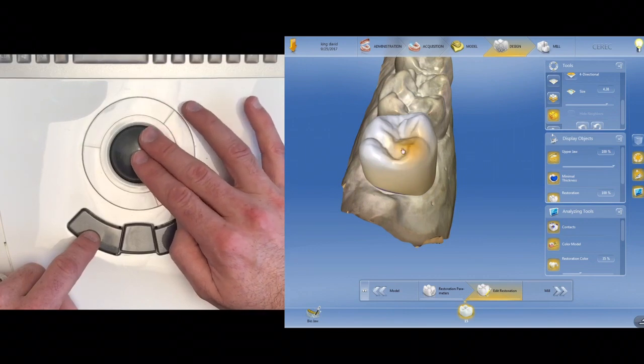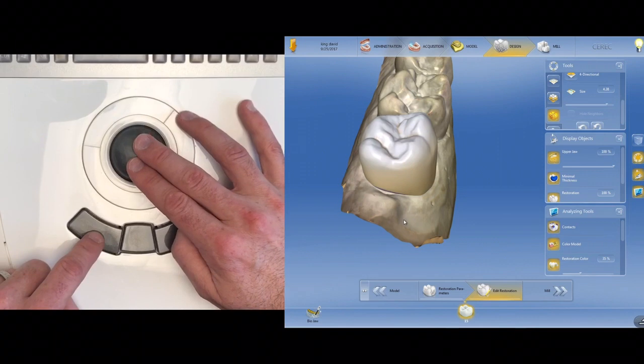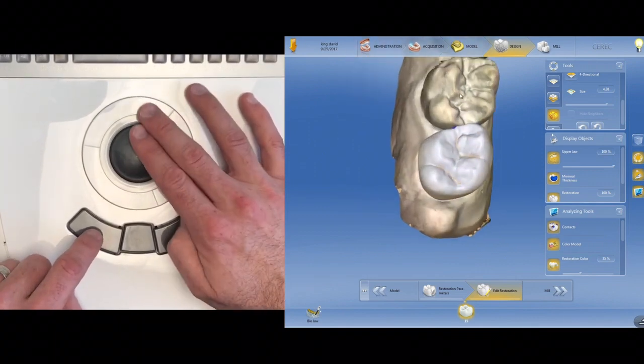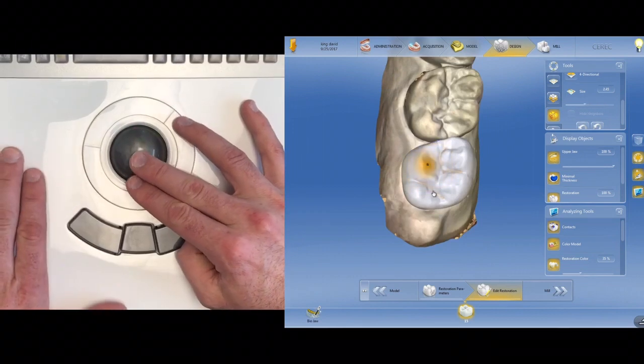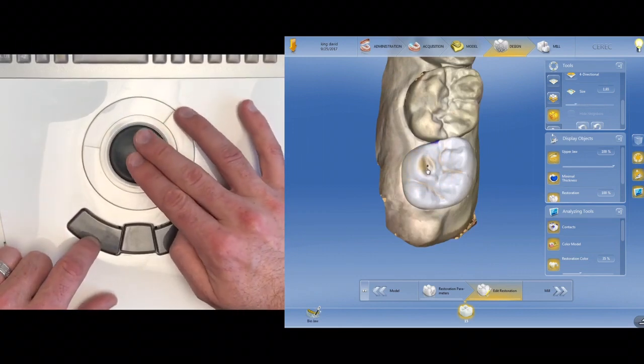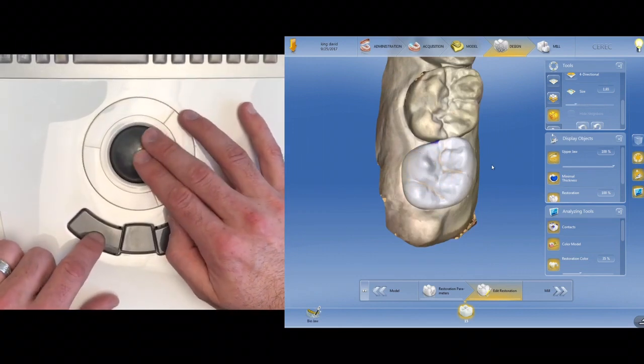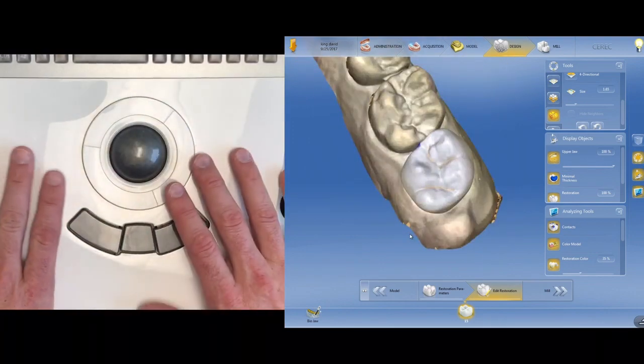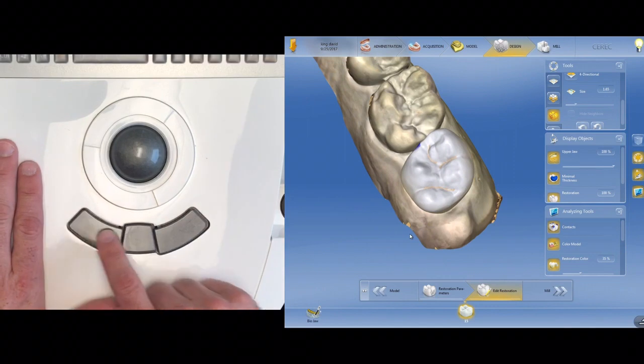So that's where some of the fine control comes. If you watch a CEREC user who's done it for years, they get really comfortable with editing a little bit, rotating, editing a little, rotate, edit, rotate, pan, change the size. You know, we can make all sorts of fun changes here. Anyway, all that being said, hopefully this has been helpful. That's kind of just a demonstration. I wanted to make sure you could see my hands in the video because it's important to be able to see how these buttons are used.